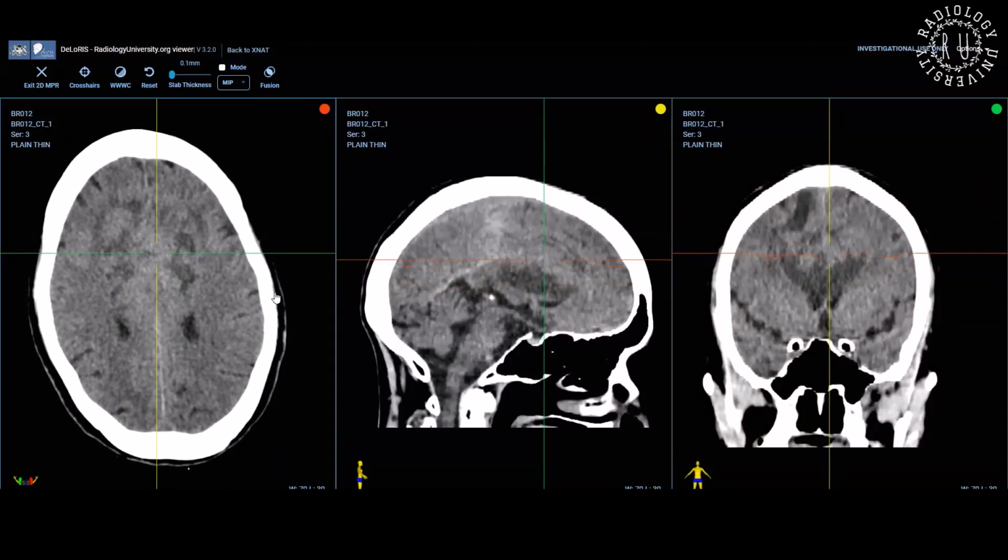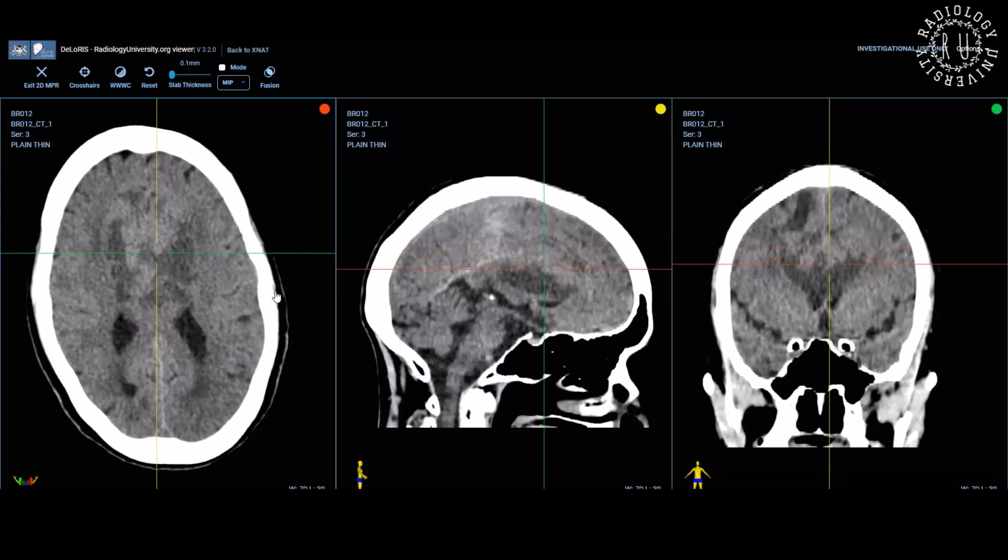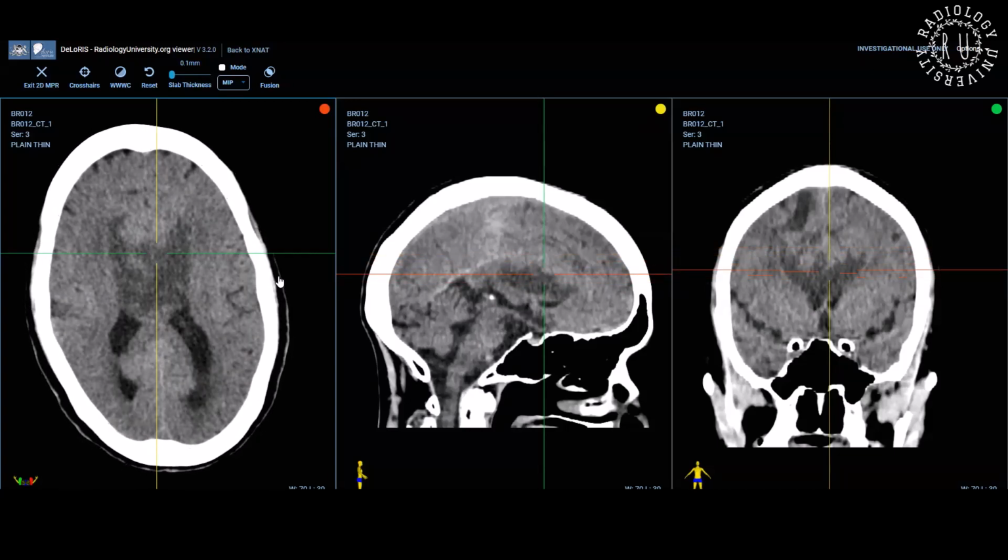What would you like to do next? Inform the referring clinical team and suggest an MRI brain with contrast to better delineate the nature of this mass lesion, which could represent a malignancy, and requires a multidisciplinary team meeting with the neurosurgical team afterwards.